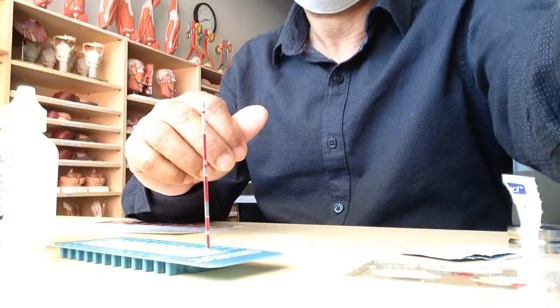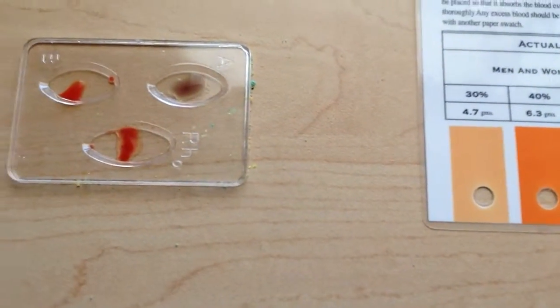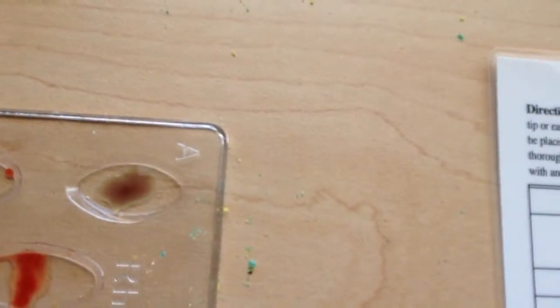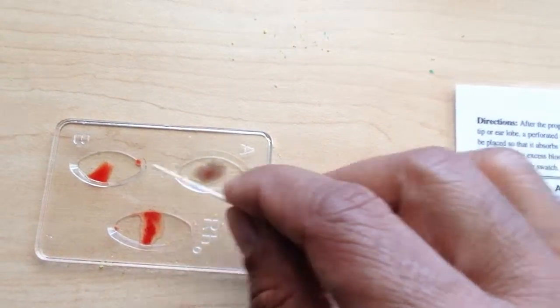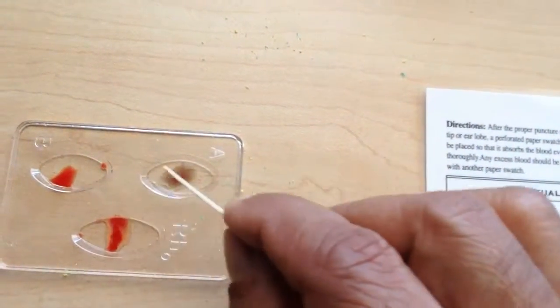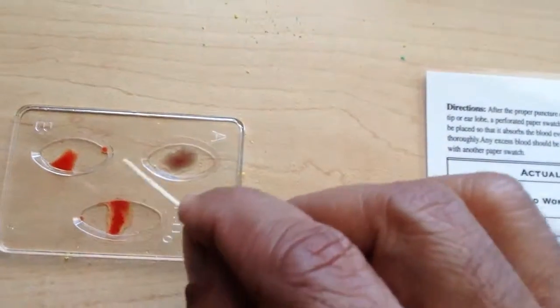Thank you. So now I'm going to show you the blood typing here. If you see this blood typing plastic tray, you see here clearly the clotting is here, agglutination is here. No agglutination is in A or B. That means not A, not B, which indicates that blood type is O. And agglutination in Rh, that means positive. So this blood is O positive.